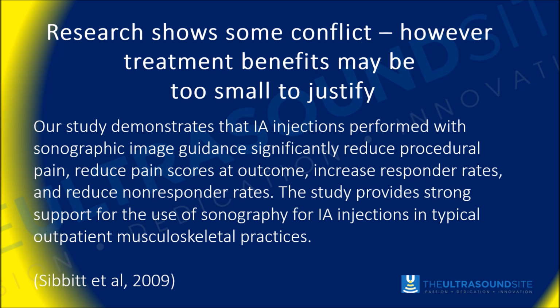But there is some conflict in the research around whether or not these advantages actually give significantly better treatment outcomes, such as to justify all of the other paraphernalia around training and machines that is required in order to perform these procedures.